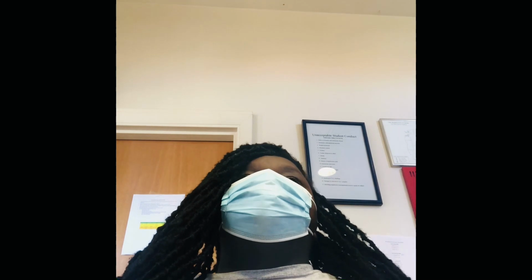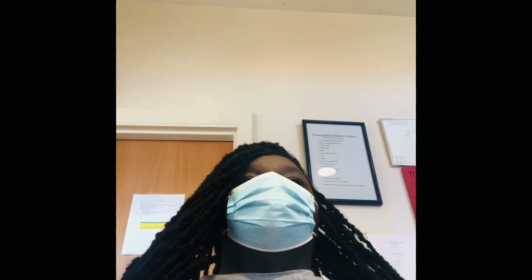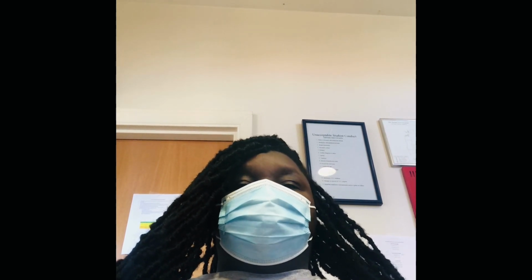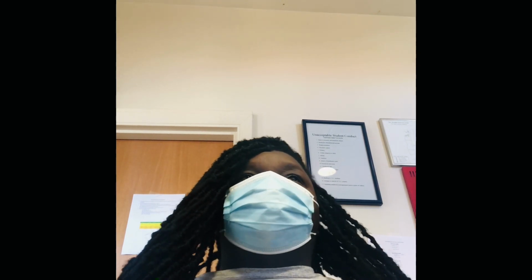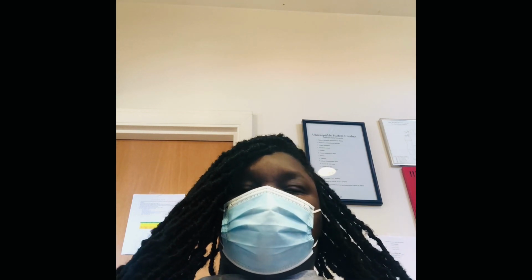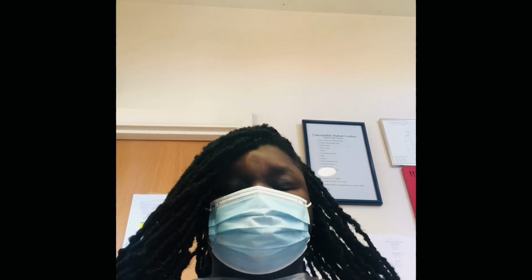Once you've done that, you're going to remove the device and tell them to give you 2 to 3 huff coughs, which is just them forcefully making themselves cough. It takes a lot of work, and there's a lot that comes with coughing, so you will have to allow your patient to rest if they need it. Then keep repeating the cycle after the huff coughing. Don't do it past 20 minutes, but continue to do it until you see a difference, until you see it's actually helping them, but don't exceed 20 minutes.